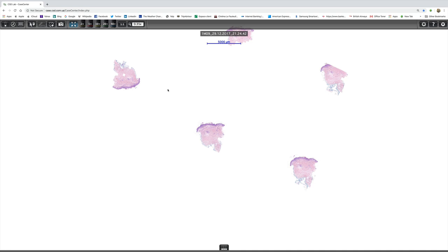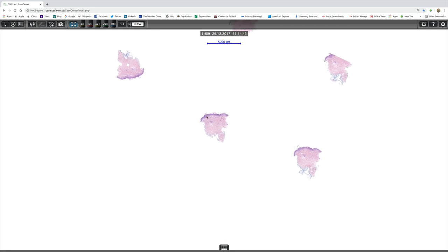And let's make it an even better clinical history. I will say that the child had a strep sore throat a few weeks previously. And even at this magnification, with that clinical history, we can look at this tiny piece of tissue and we can make a diagnosis of guttate psoriasis.